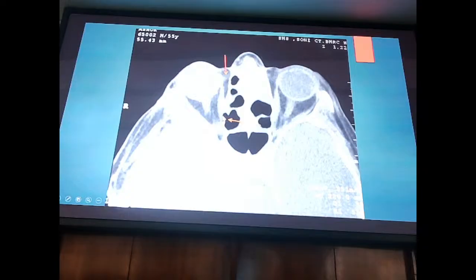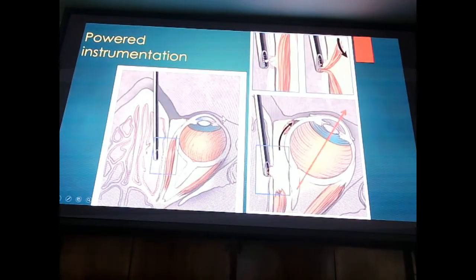I am directly on the muscle. When PJ Verma and I did a cadaver course together, I just told him about this interesting idea. Let us see, anyway it's a cadaver, let us just see how much time it takes with a debrider to eat the muscle in the posterior ethmoid. So we had opened the posterior ethmoid, we had left the periorbita intact, we started the timer.